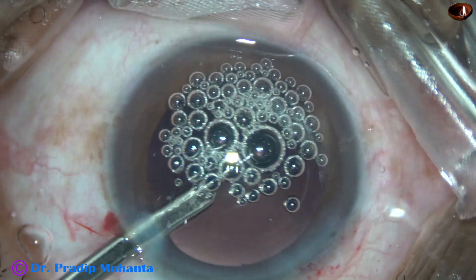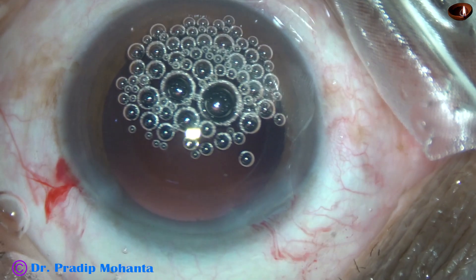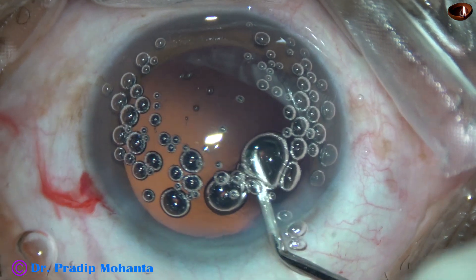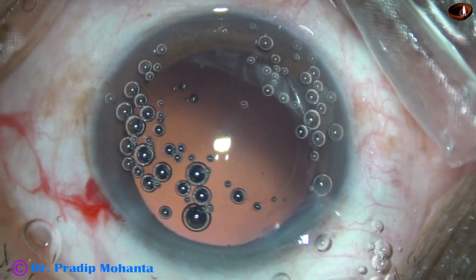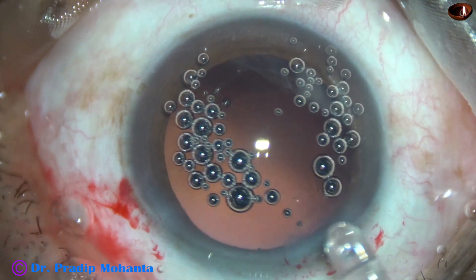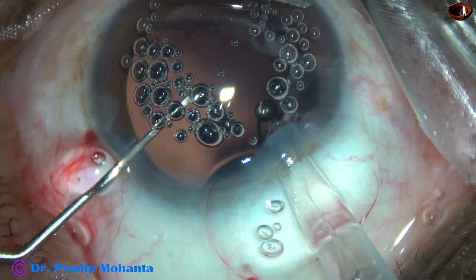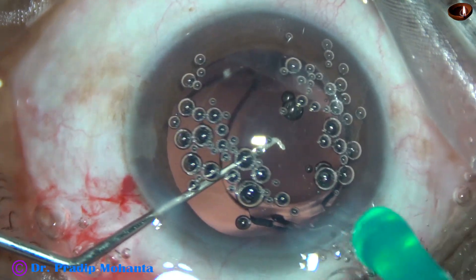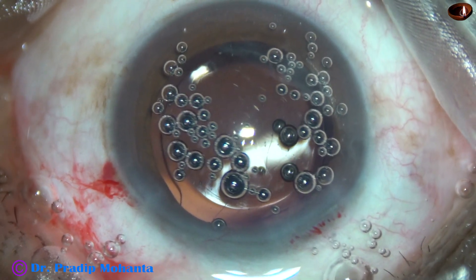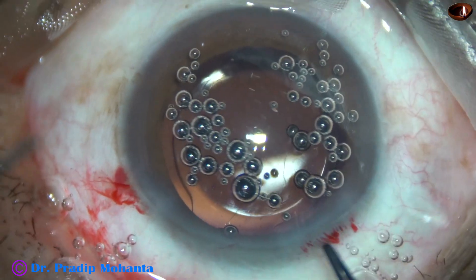Cortical cleanup has been done. And now I am going to use visco to help me implant the intraocular lens. The visco has filled the anterior chamber, and a hydrophilic acrylic single-piece monofocal intraocular lens is implanted in the capsular bag. The intraocular lens has gone into the capsular bag, and the haptics are in the equator of the capsular bag.